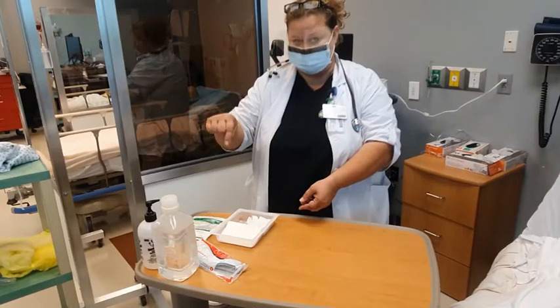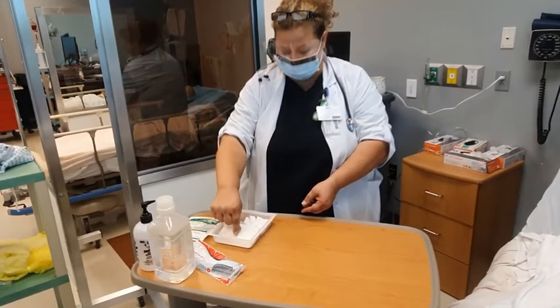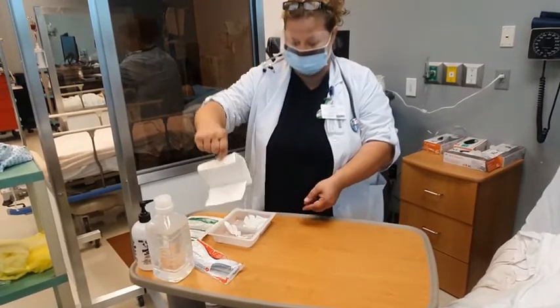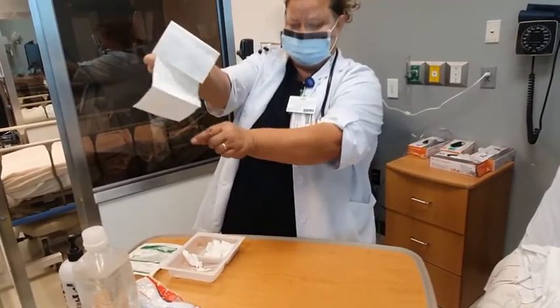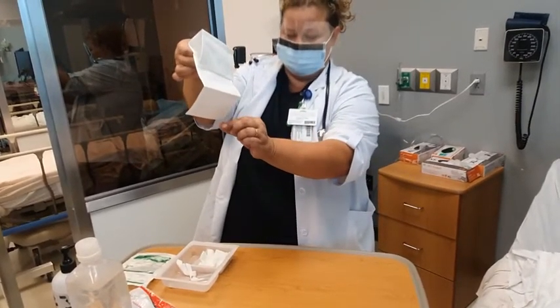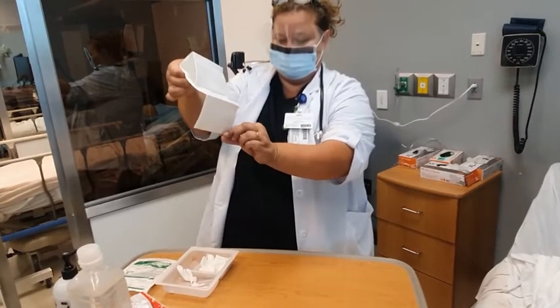At this time, you can get the drape. There's a shiny side and a flat looking side. You're going to actually pinch it up. It's going to feel slick, okay? And you know you're pinching it up, and you're looking for a corner. See down here at the bottom, you're looking for one of the corners, because you can only touch the outside corner. As so.